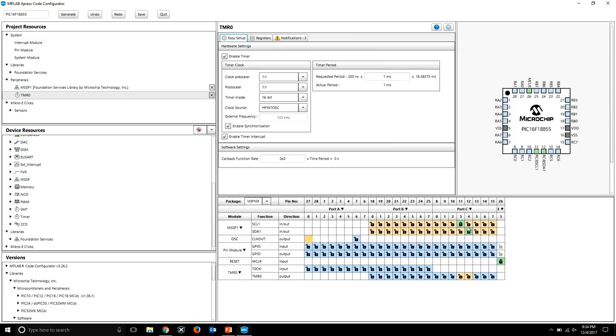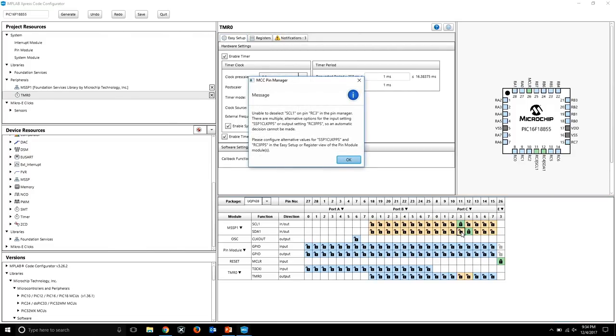Now, if we go back to our pin configuration, there is a default selection of RC4 and RC3 for SDA and SCL. So this is kind of reversed from what we need to do. You would think immediately, why don't I just click RC3? And look at that, it's saying you cannot do that. Now remember, Edwin, you're asking what the color codes mean. In this color code, you can see this is all orange, so once you select one, that means you can select only one in the row, and it will move.